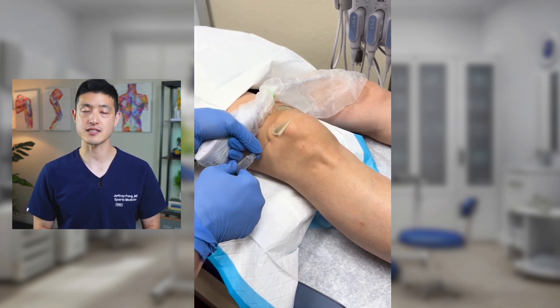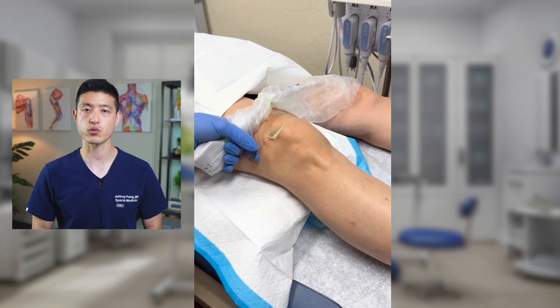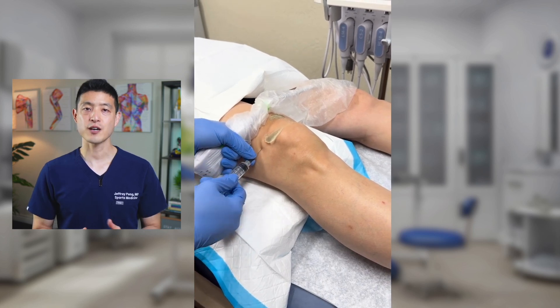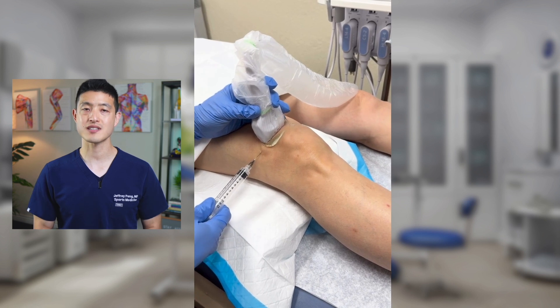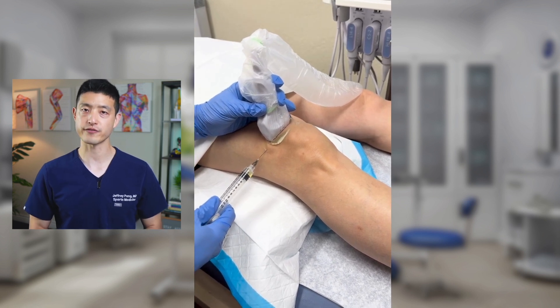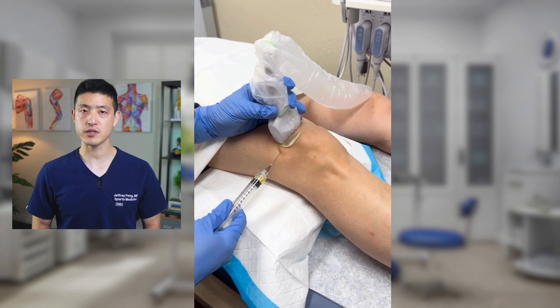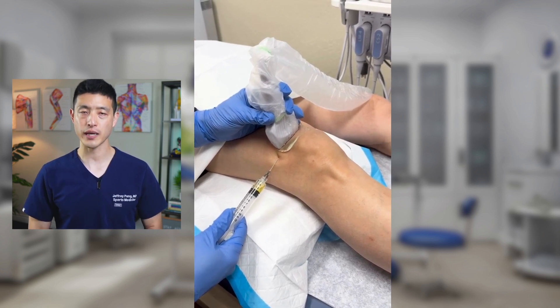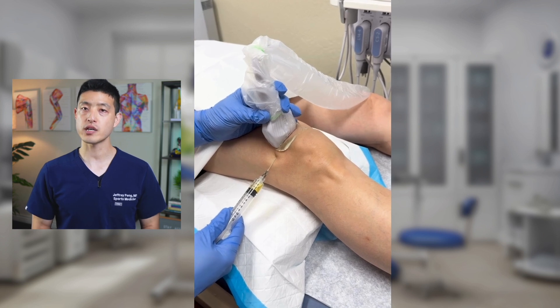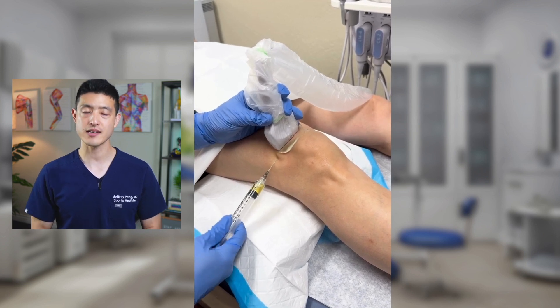I'm using ultrasound guidance to ensure the needle reaches the joint space accurately. Now, this patient had a bit of swelling in his knee, so I'm switching syringes to aspirate some joint fluid first. It's not a large amount, but this inflammatory fluid, common in arthritis, can be a big source of pain. Removing it before injecting PRP is always a good idea.